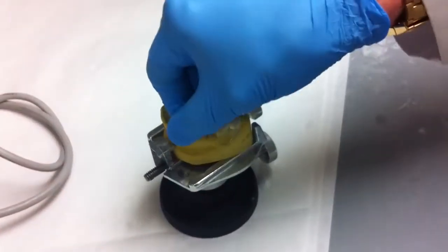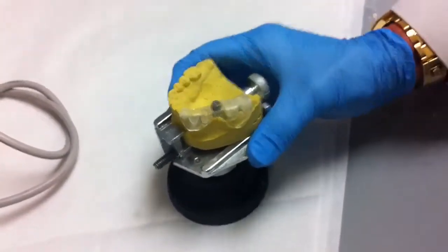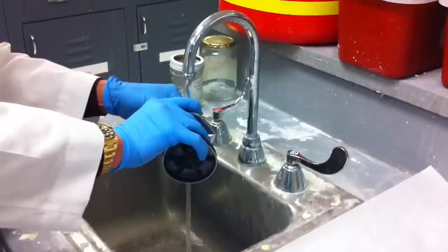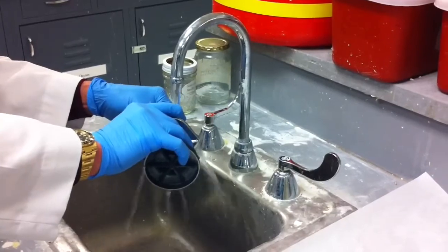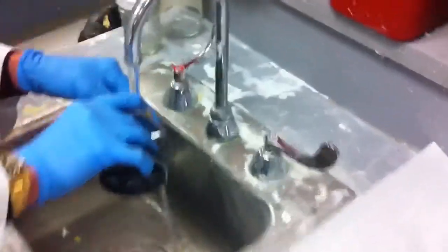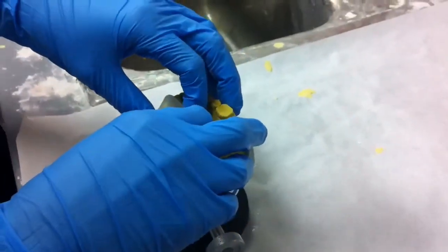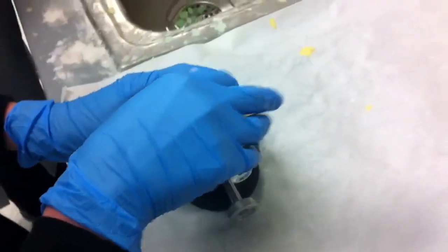If you want, at this point you can run it under cold water and cool it back off. It's somewhat rubbery, so don't be too quick with it. Just kind of ease it off. Straight up — it's got to go... There you go. Perfect.